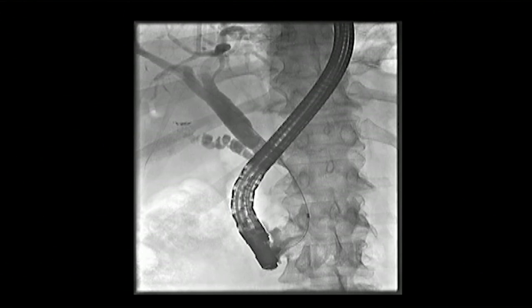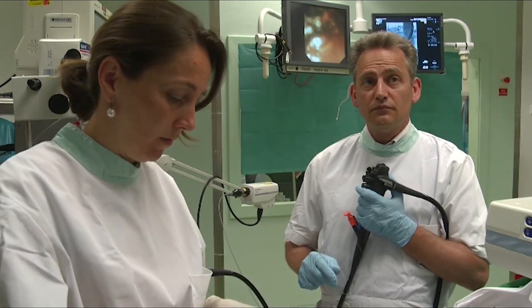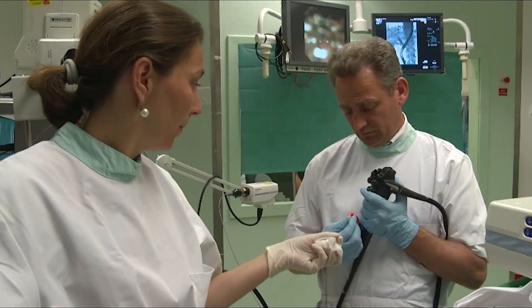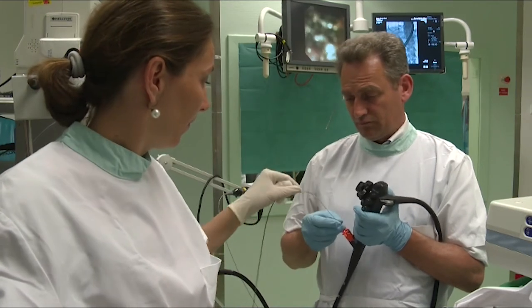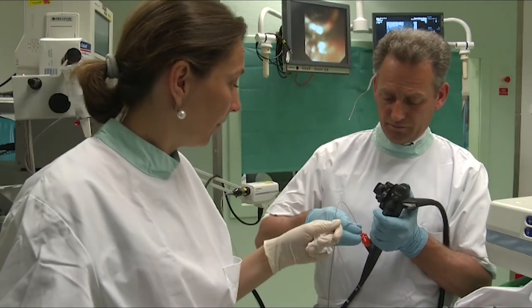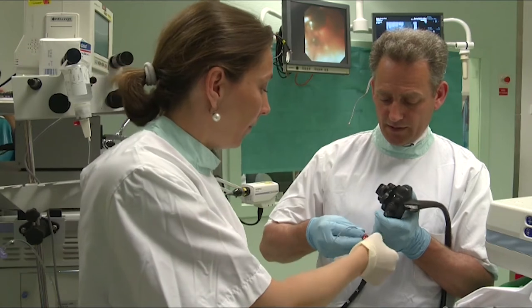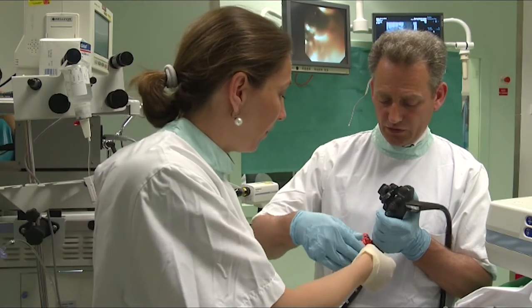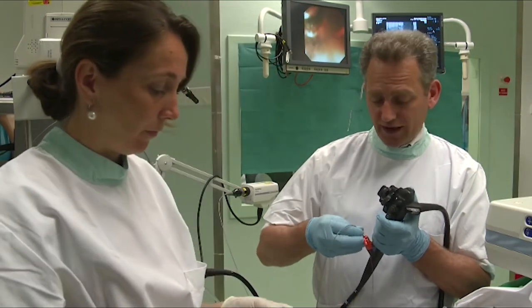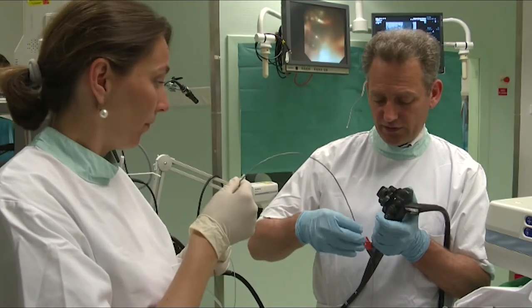So we'll remove the catheter and introduce the IDUS device. So we carefully will introduce now the IDUS catheter into the scope. We have to be very careful not to kink the device. We slowly introduce it.